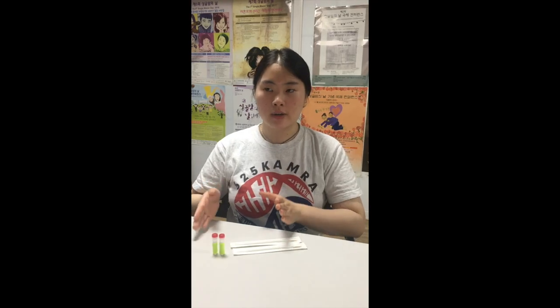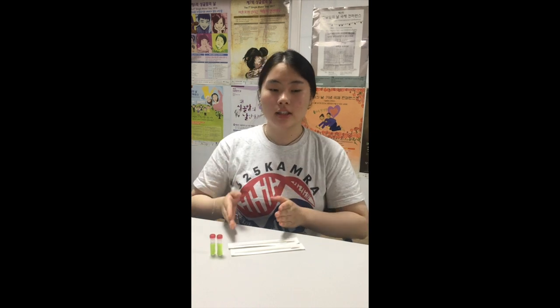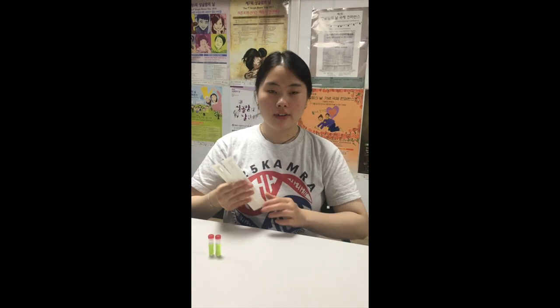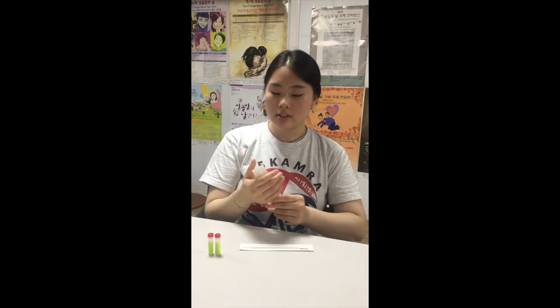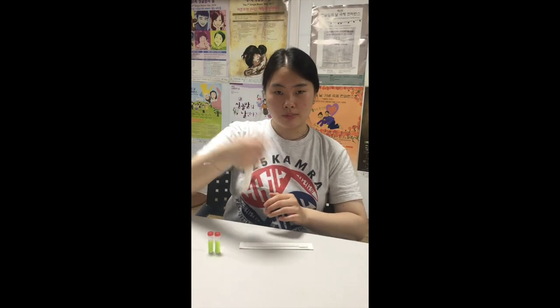Before we talk about what you should do prior to testing, there is one thing I'd like to mention. We have the 2009 version of the DNA kits, so this is the one where you push, not break off.